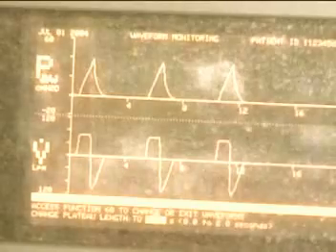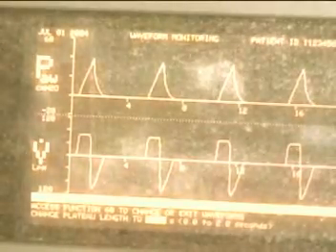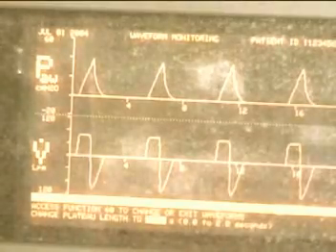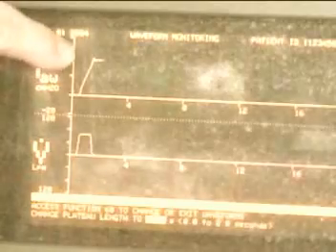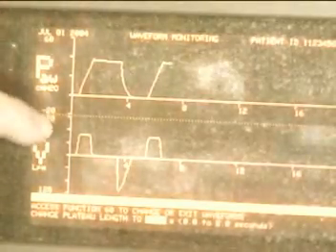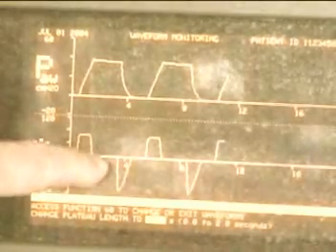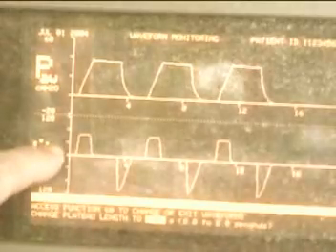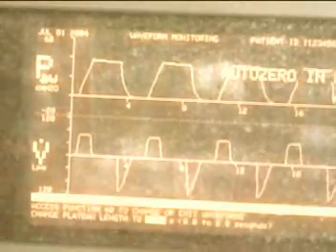Now as we add plateau, take a look at what the plateau breath looks like. And now you see the inspiratory hold, the plateau. And down here, no air flow going to the patient. And so you have this gap. Flow in and nothing here, then exhalation.